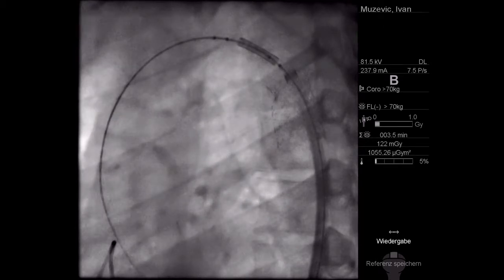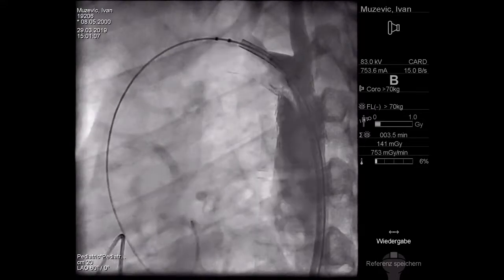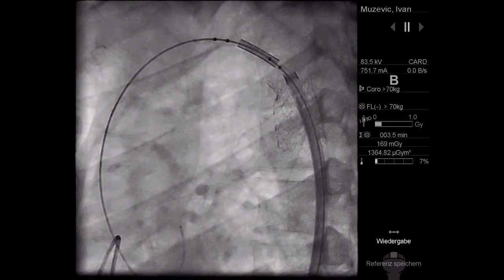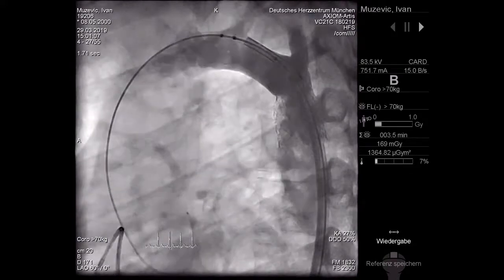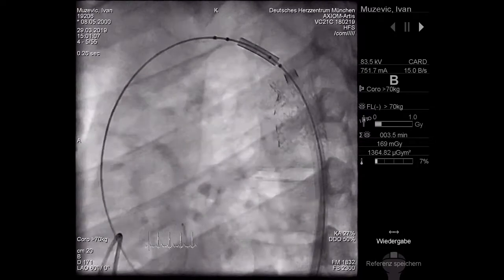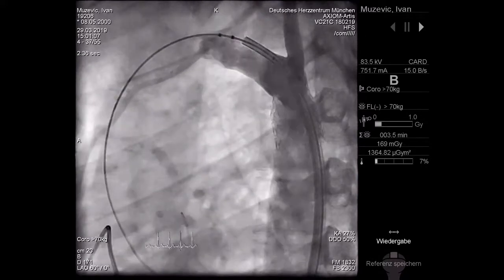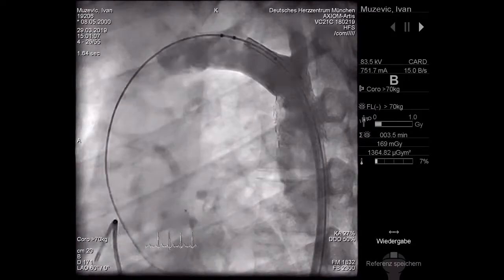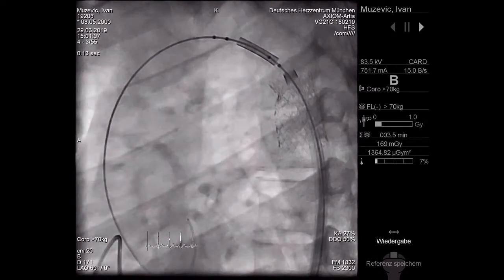But now we have to check once again where the best position is. Can we just take B, please? Okay, perhaps a little bit back. It is interesting that it looks better just by tenting it with a wire and the lesion. It's a good landmark to have this rib down there. Some tilt, a bit of a bend. I have a tendency to put it a little bit more to the rib than anteriorly. I think we start with inflation.